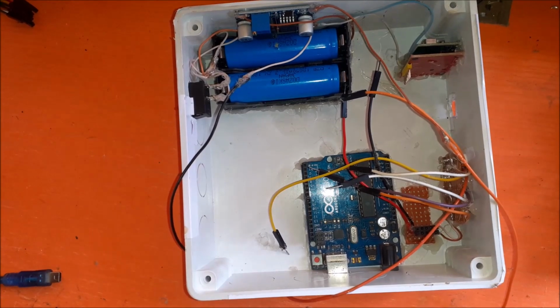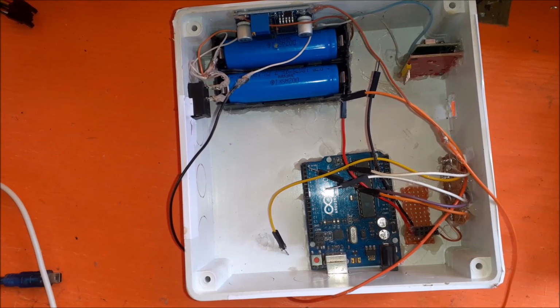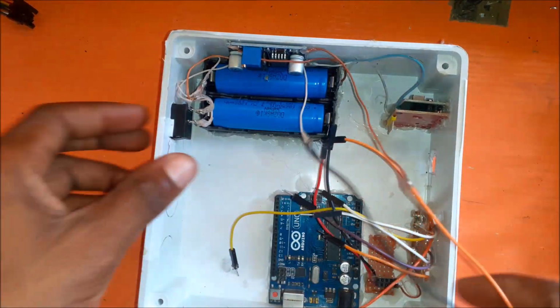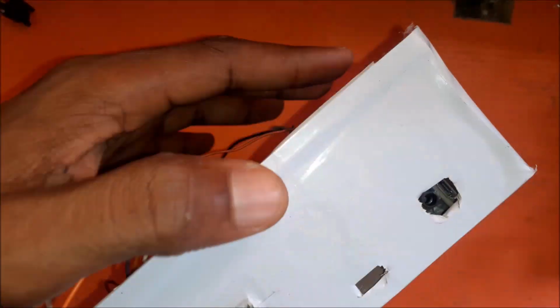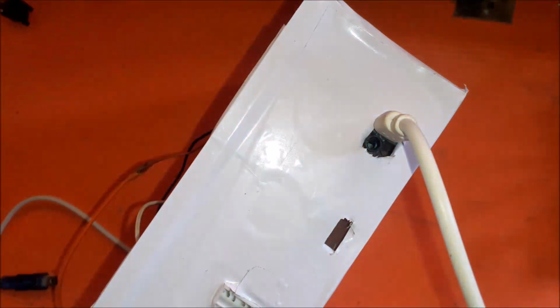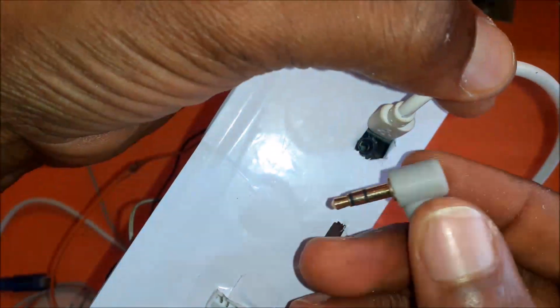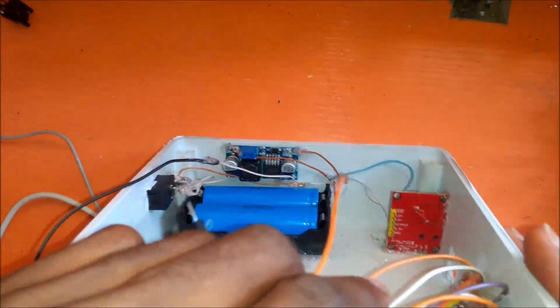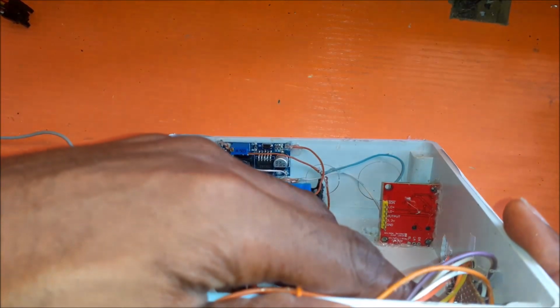ECG sensor is placed inside the enclosure while cutting out a through way for its jack plug-in. To make it accessible, we placed it in a vertical position. We needed to recharge the batteries whenever their power was depleted, hence we use a LiPo charging module which has a Type B charging USB port and we can conveniently charge the batteries when we want. This is also close to where the ECG sensor module jack port is located.